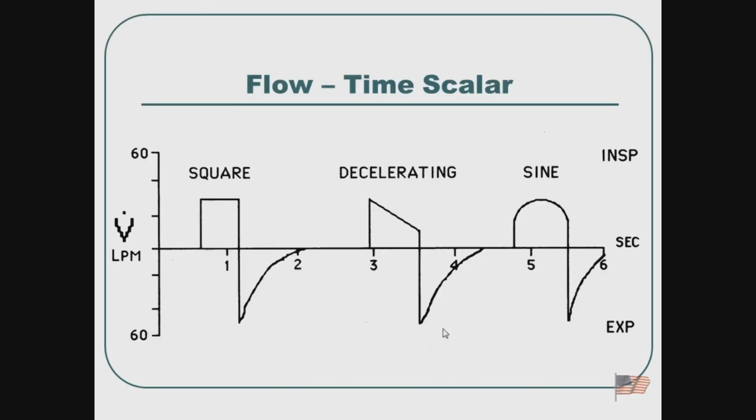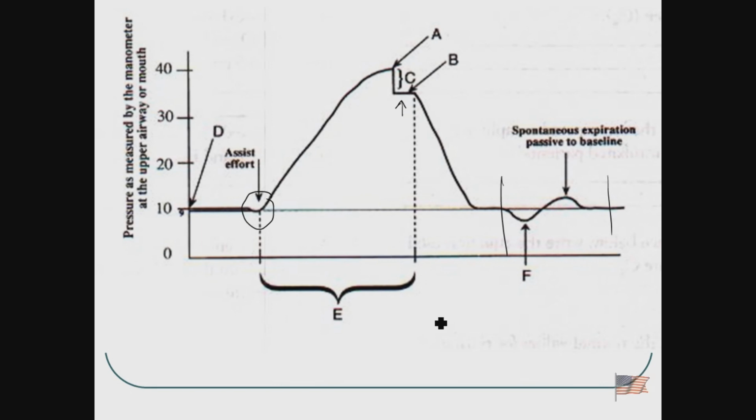In the last one, what did you say this circle was? The one that you, here? Yeah. It's a patient trigger. So the patient's initiating this mandatory breath.